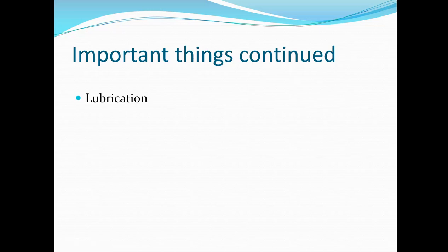Okay, again, some more important things. We want to use lubrication for the end of the tube that we're using, and we're going to use a water soluble lubricant to make it a little bit easier for the patient, especially if it's going up the nose. We know that's going to be very uncomfortable, so we want to make it as comfortable as possible. And again, things to remember, applying suction, we only apply on the way up, and only for about 10 to 15 seconds, okay, no longer than that.